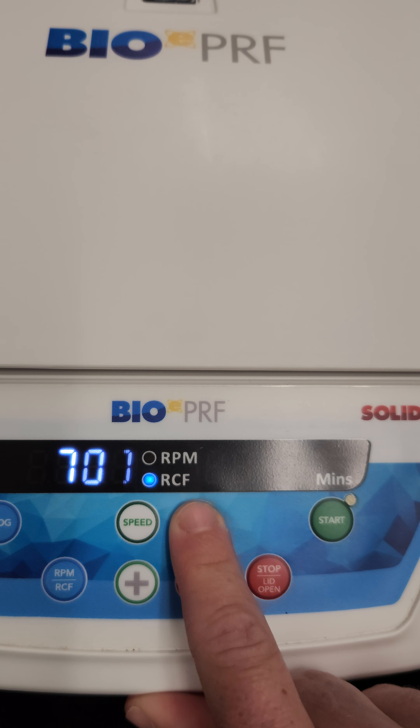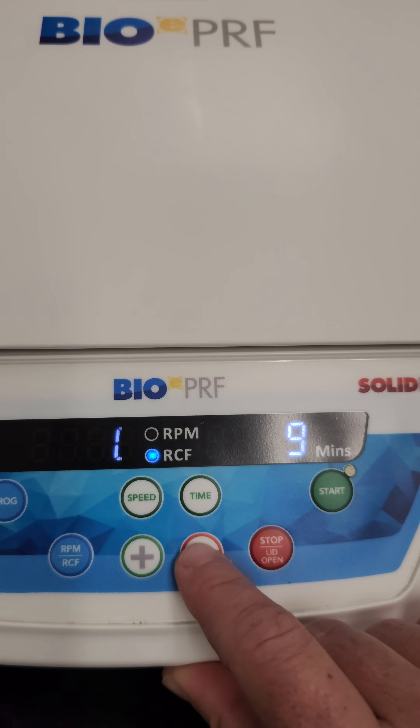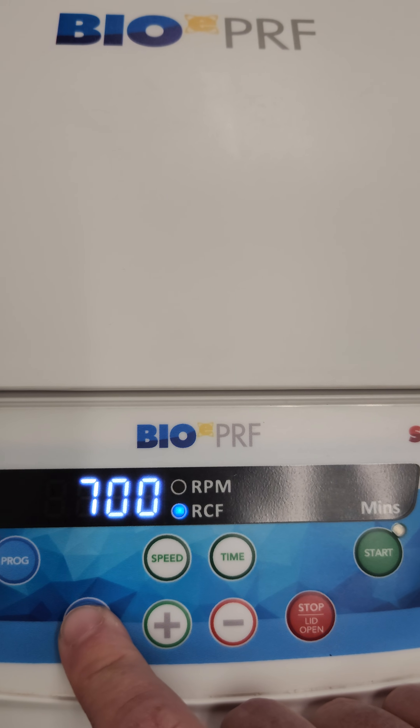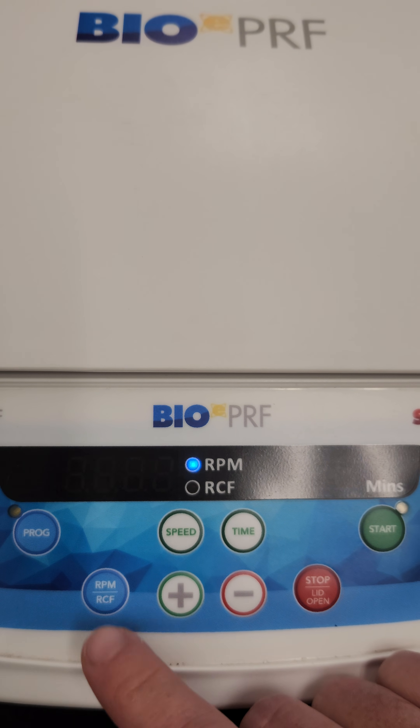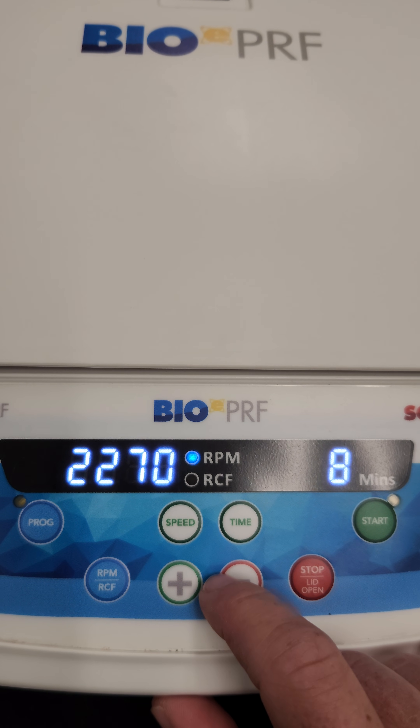If you want to change the time, hit the time button and use plus or minus. If you want to change RCF to RPM, press that button right here. The same way to change either the speed or the time.